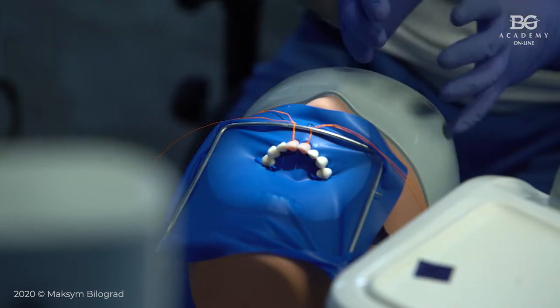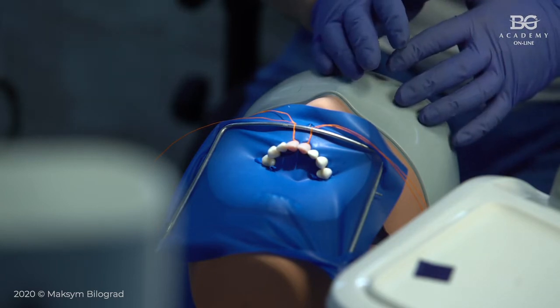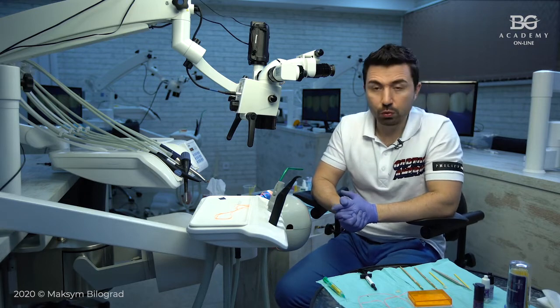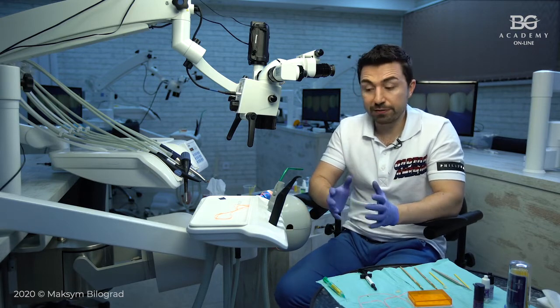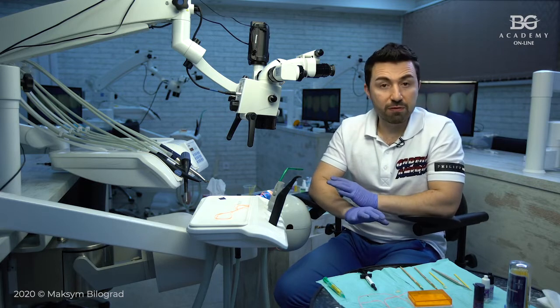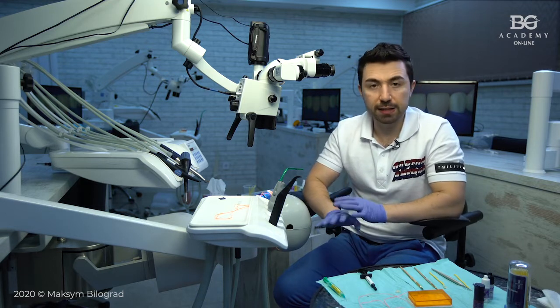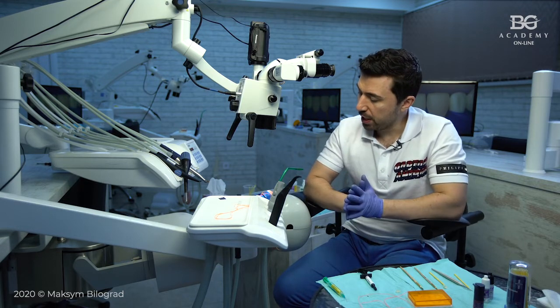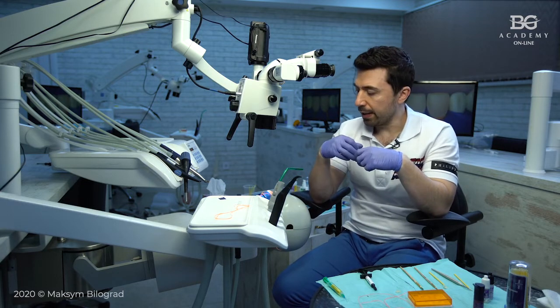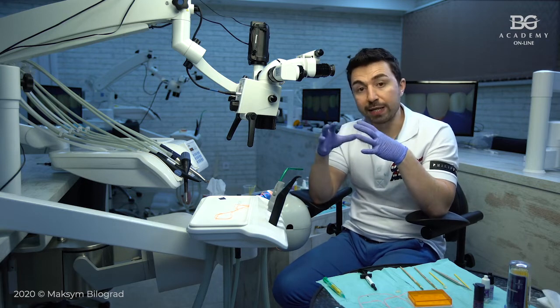We will prepare tooth surface for cementation process, and we will discuss with you three clinical cases or three clinical conditions. The one when you have everything in enamel, okay, just no dentin, no fillings, nothing, just enamel. Another thing is when you have enamel and some exposed dentin. And the third one will be enamel and filling, or enamel and IDS.